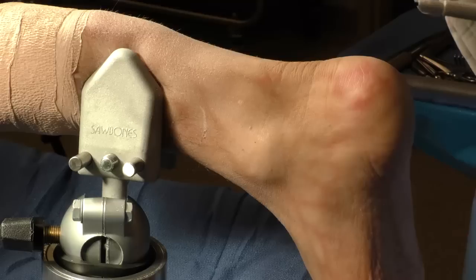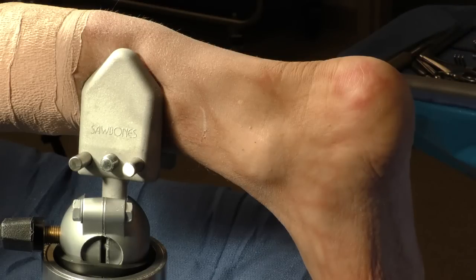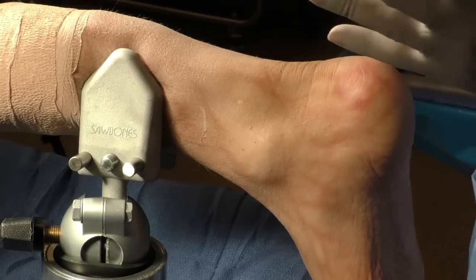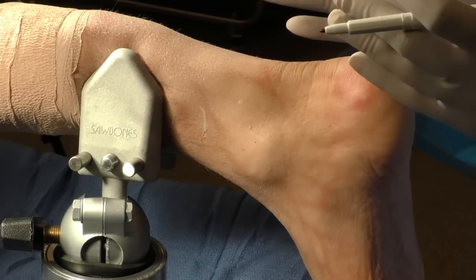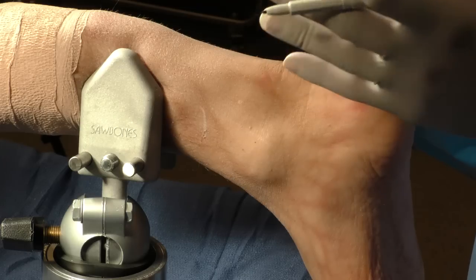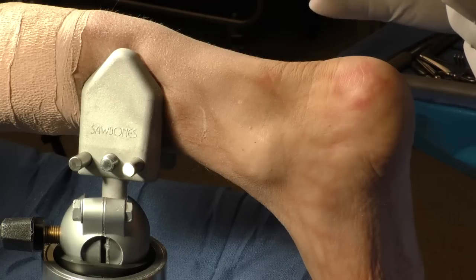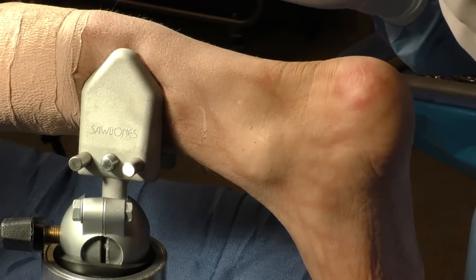As I've described before, you can put the posteromedial plate through the posterolateral approach. However, in some cases that can be difficult, so we'll also show you an accessory posteromedial approach as well. We're going to start with the posteromedial approach, because I think it's something most of us will want to do. The hesitancy with the posteromedial approach is the neurovascular bundle, and what I want to demonstrate is that you really don't have to get into that.